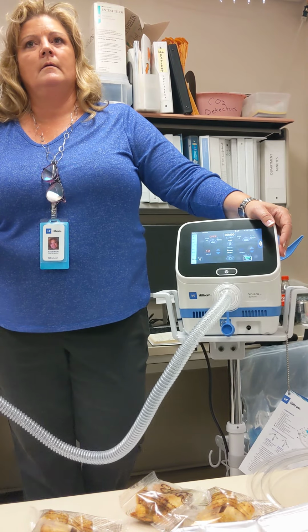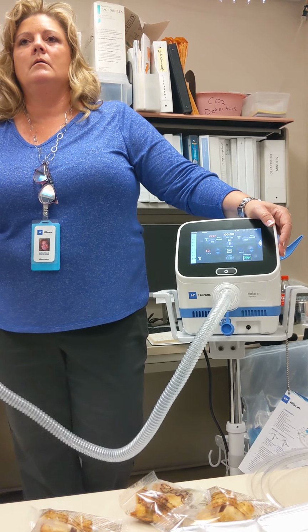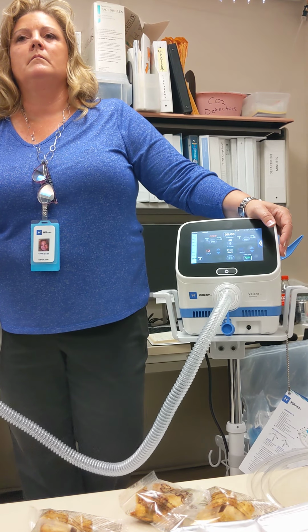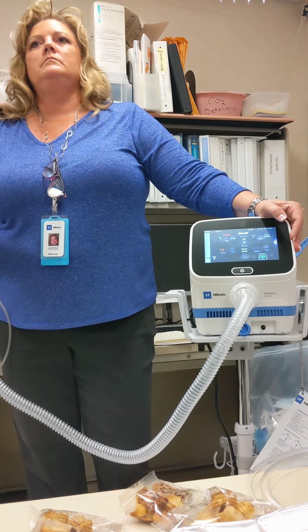All right. Question. So we had a patient who didn't have a lot of chest wiggle because he was more of an abdominal breather. So aside from chest wiggle and chest x-ray, what am I looking for to know that my treatment is effective?